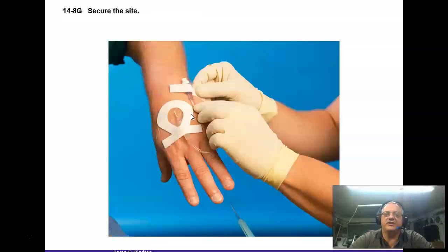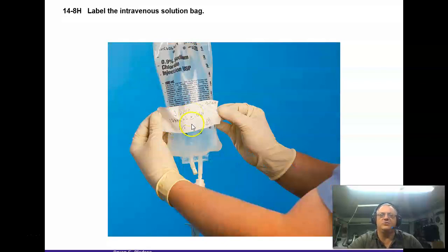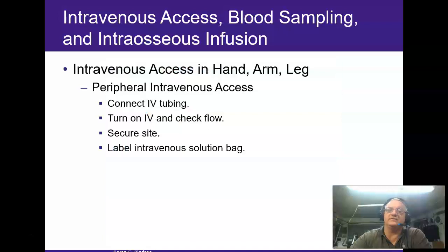Again, turn on your IV and check for the flow. And by the way, a lot of systems I've worked in actually use this particular setup. It's a beautiful thing. My only problem with this one is that it actually puts it over this and that, so you've got to take the whole dressing off. That's why when we were talking about starting an IV, I said to put the Tegaderm just strictly over the site area. And make sure that you label your bag with who started it, when you started it, how you started it. Especially for a field, and especially if you added something to it, you definitely want to put some sort of labeling on there so that they know where this came from.